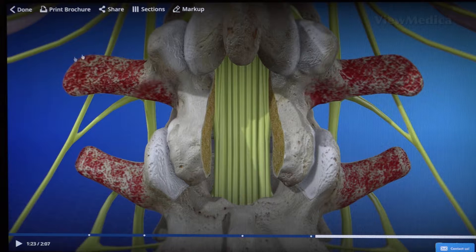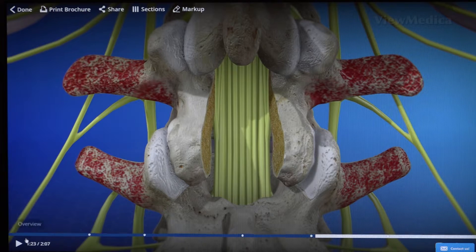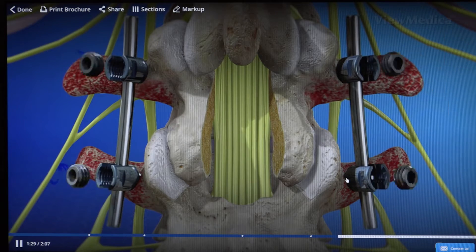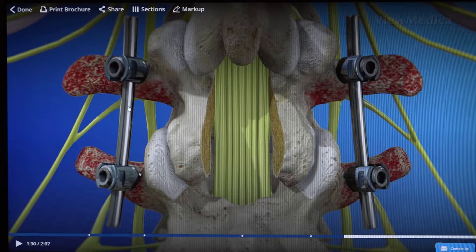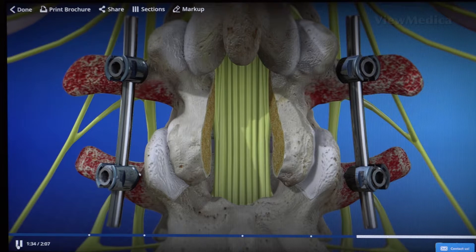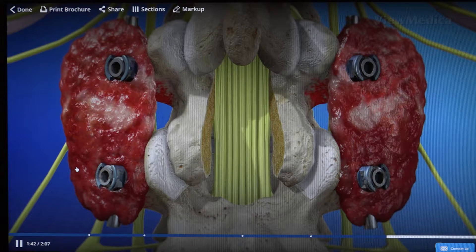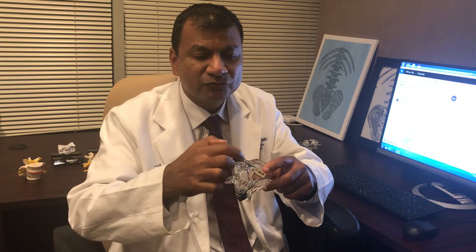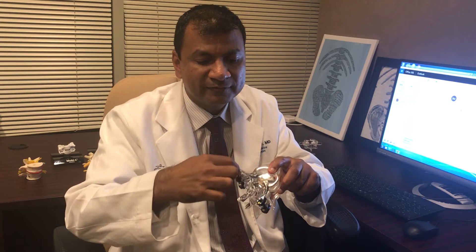After relieving the pressure on the nerves, we prepare the area where we're going to do the fusion. The bones marked in red are what we want to fuse together. Under navigation, we place the screws into the vertebral body, subsequently put a rod connecting this screw to the screw below it, and then put a set screw to ensure the rod does not come out from the pedicle screw. After placing the instrumentation, we place bone graft — from cadaver bone — around these screws and over the bones. The screws go into the bone with the spinal cord in the middle, which is a safe placement.